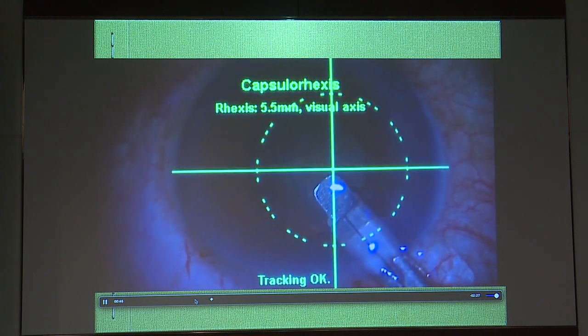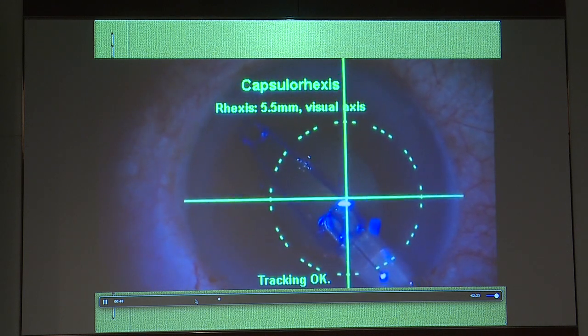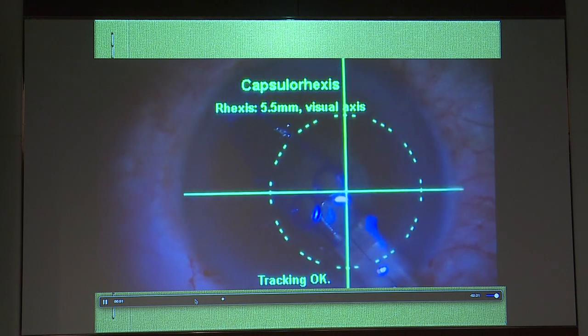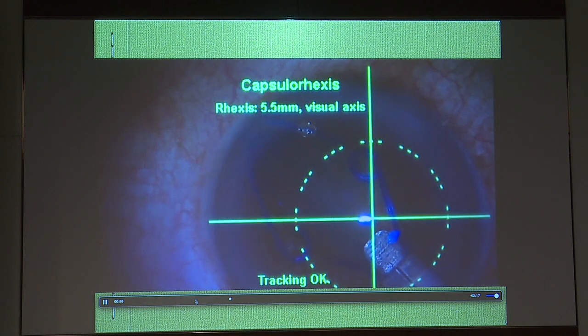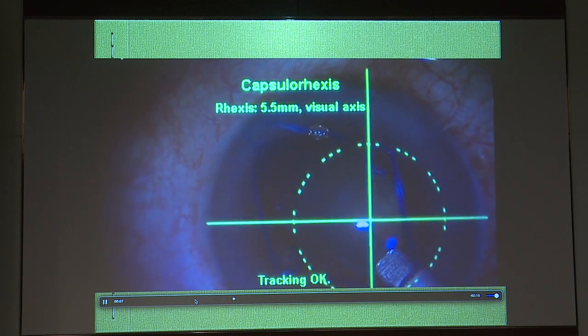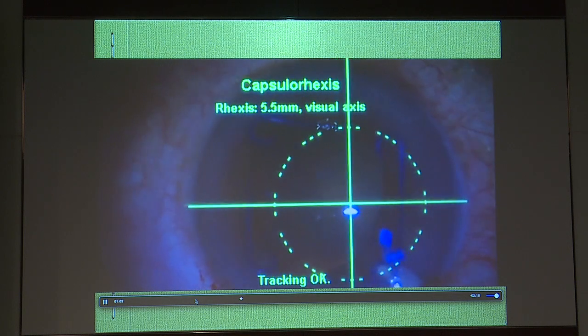The plunger is just going in. You have to scroll one end of the loop into the iris, and you can do it as a one-step procedure. You need to tilt your hand a little bit to the left, a little bit to the right, get the iris into the loop, and you are done. So in one shot, you're getting 3 loops into the iris. You can even do the 4th one in one shot.